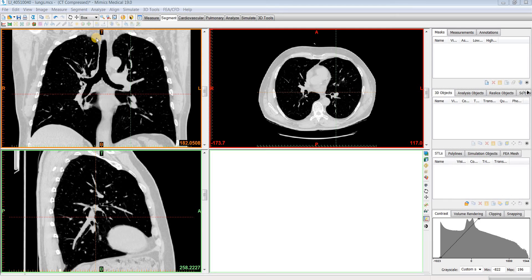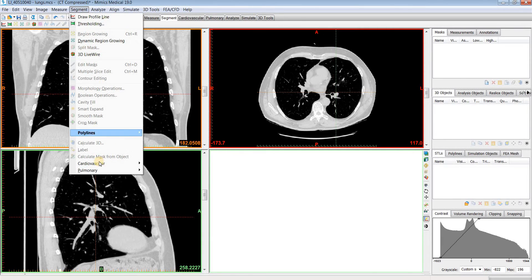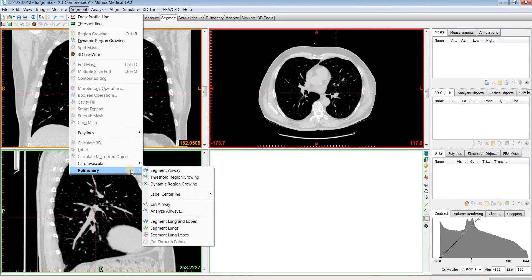In this video, I will use the Mimics Innovation Suite to show you how to automatically segment an airway using the Segment Airway tool, which is part of the pulmonary module and located under the Segment menu.